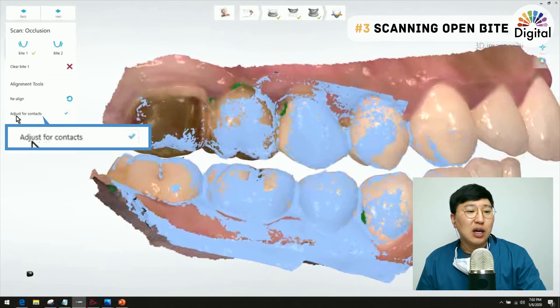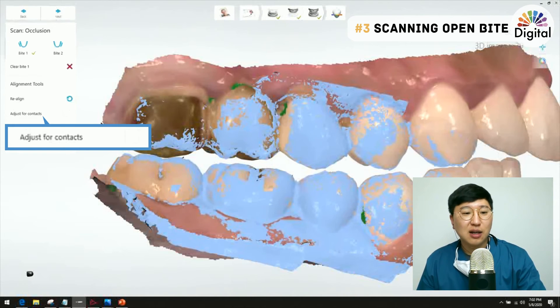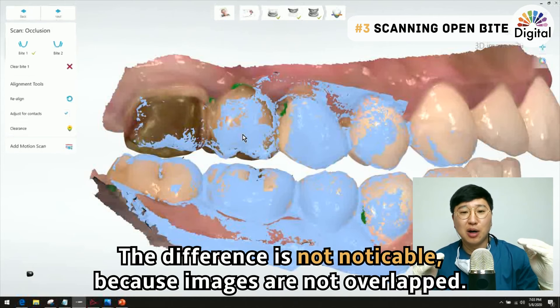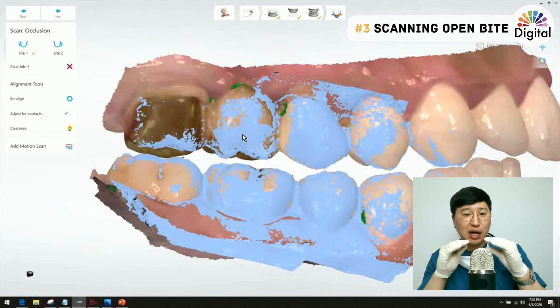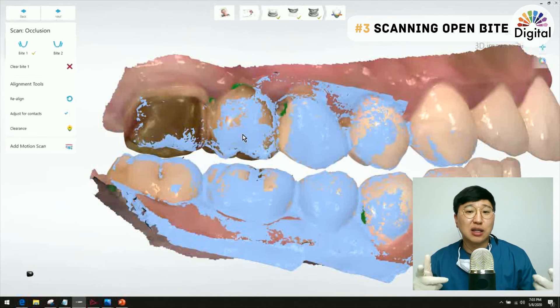After alignment is done, we can see the 'Adjust for Contacts' button. Let me turn it off and turn it on again. Did you feel something different? Only a tiny bit of change — almost nothing happened — because there are no overlapping images. We already don't have over-contact, so the system does not do any adjustment.